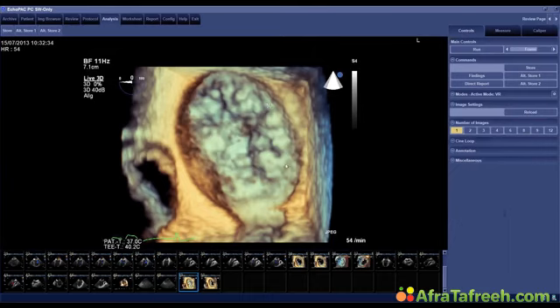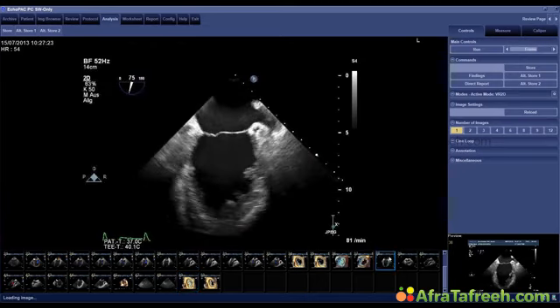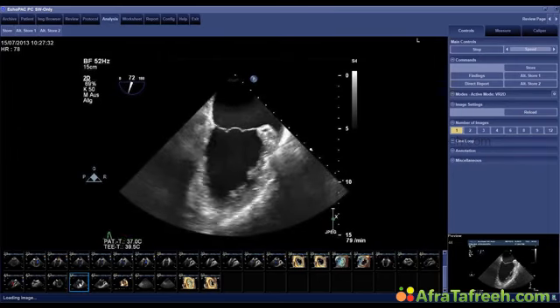What I'm trying to say is that if we have a certain four-chamber view and we cut through it, somewhere like here, and we have a little jet here and here, this is explainable because this is maybe not only an anterior or posterior leaflet, but it's separated into little leaflets which can have all sorts of different jet origins. This is something to keep in mind, and it is very important when it comes to a special procedure we'll be talking about maybe later. Okay, this is the TEE study.